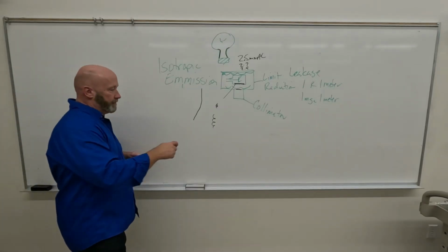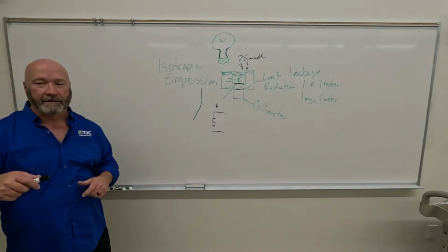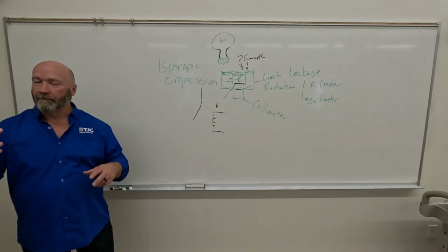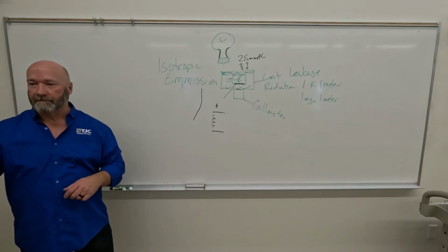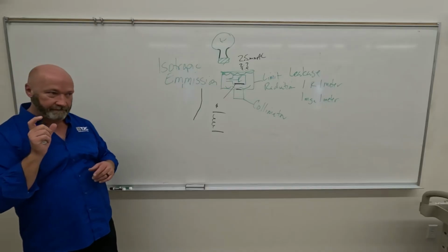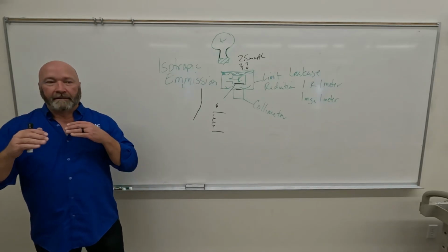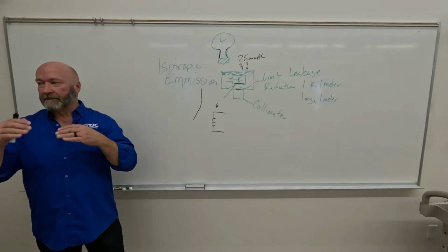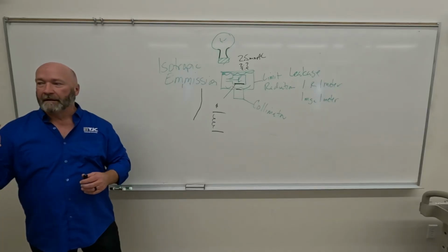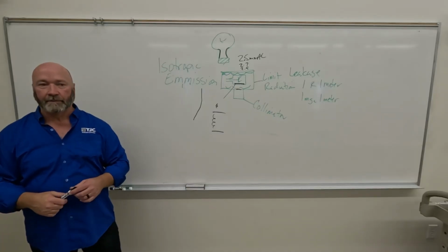going back to our focusing cup, in X-ray units that need very rapid exposures, what we refer to as serial exposures, which is image, image, image, image, right? It's not fluoroscopy. They're still radiographic images, but they're in quick succession. Like cardiac catheterization, they want to make an image and then another image, another image, another image, with fractions of a second in between.